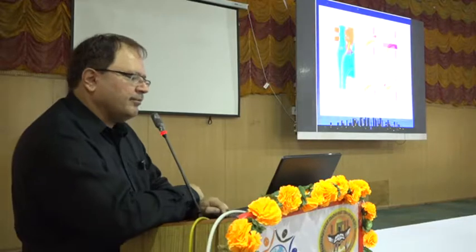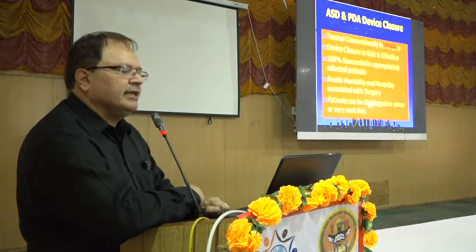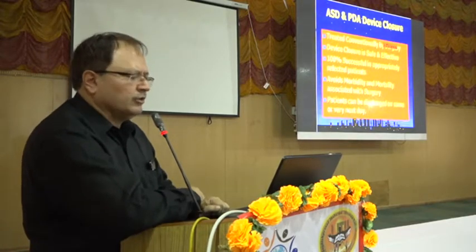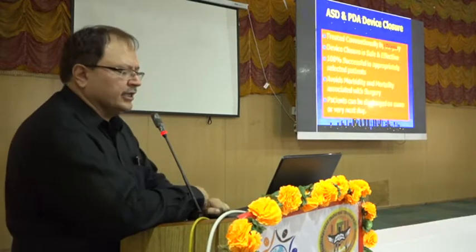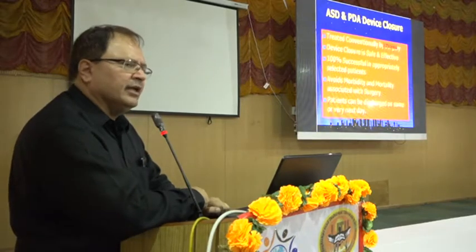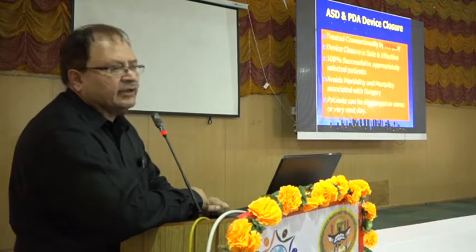So we are doing a lot of pediatric work also. We are doing ASD, VSD, PDA, and ruptured sinus of Valsalva closure with devices. The conventional treatment is surgery, but nowadays for all ASDs, PDAs, and RSOVs, we have replaced surgery with devices.